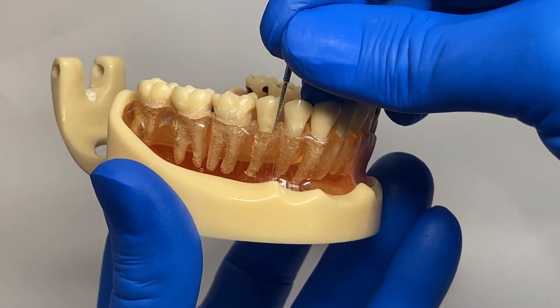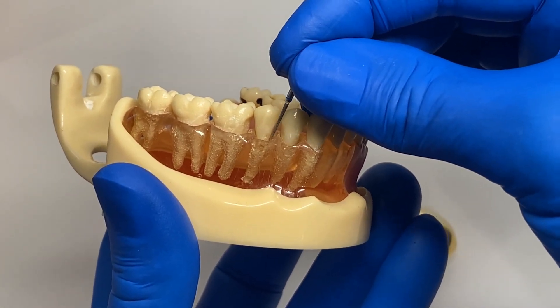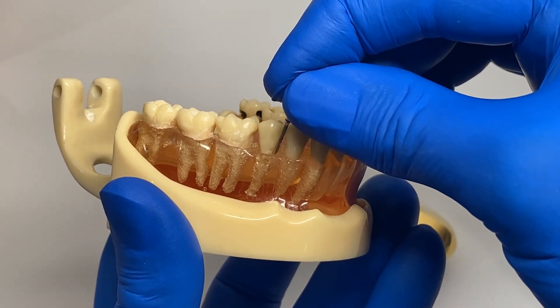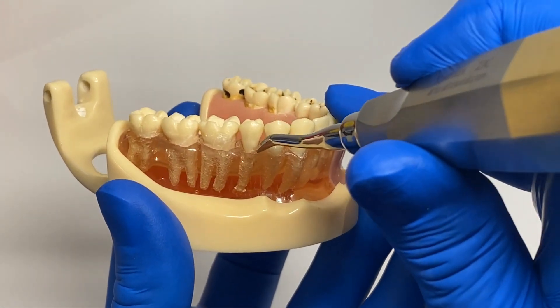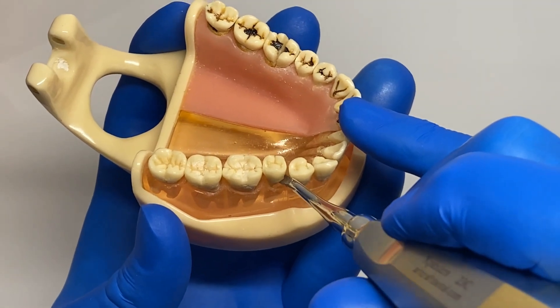Aim the flame into the sulcus and lean it back slightly. Drill down about three millimeters deep and make a trough about three millimeters wide. Now you can insert your elevator into that trough, twist and move the tooth laterally.